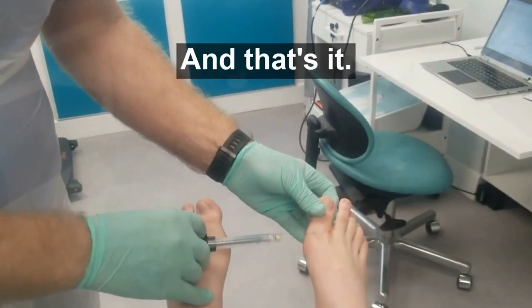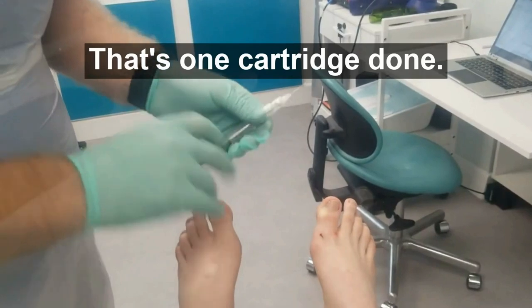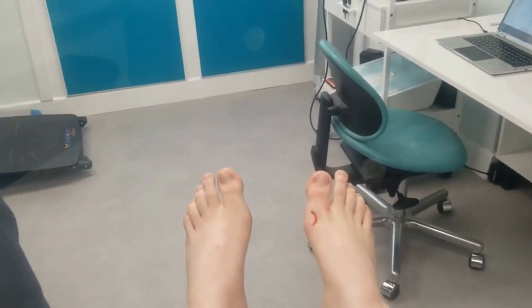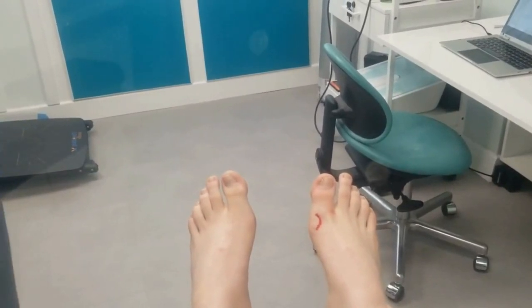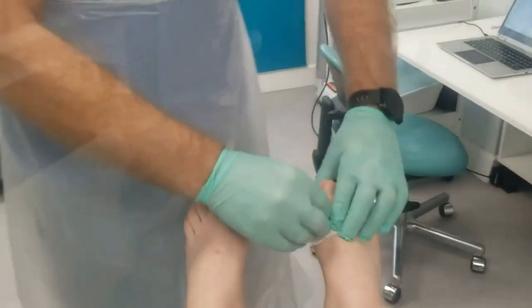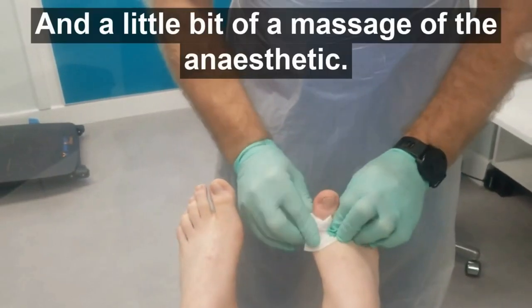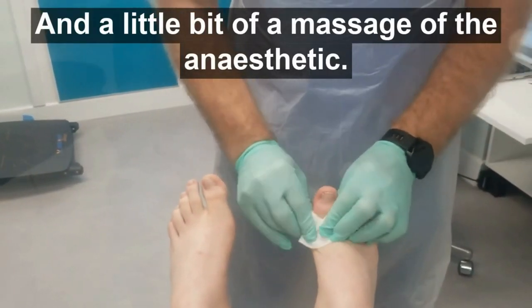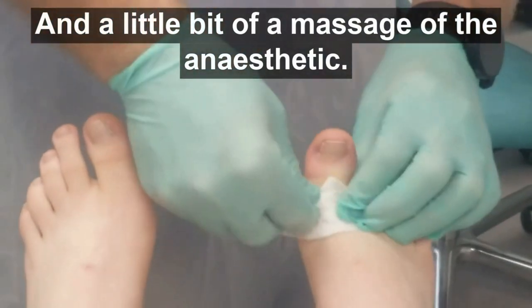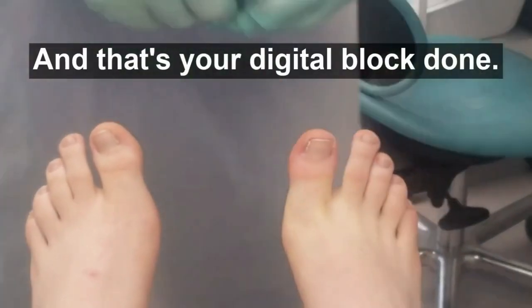And that's it — one cartridge done. Close that off, and a little bit of a massage with the anesthetic. And that's a digital block done.